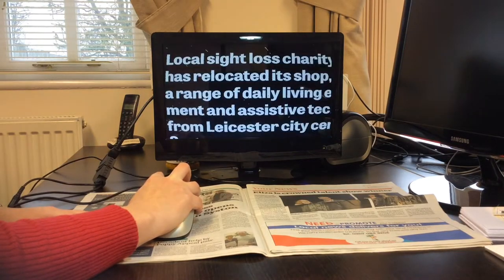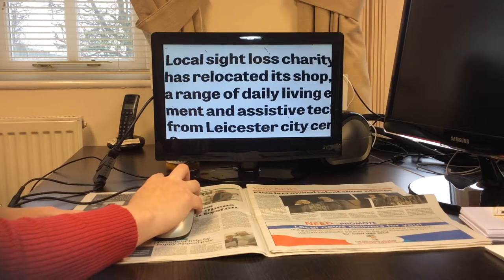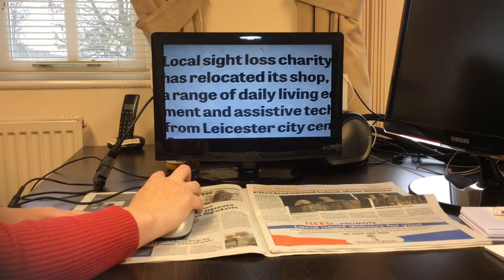Press the mode button to change from grey scale to white text on black background, again for black text on white background, and again to return to grey scale.